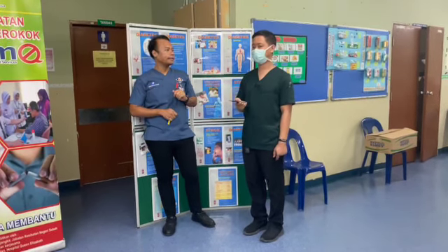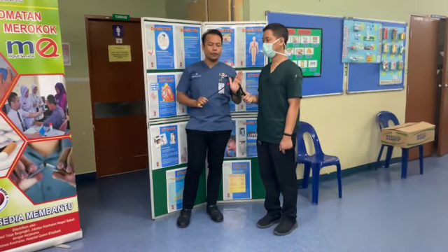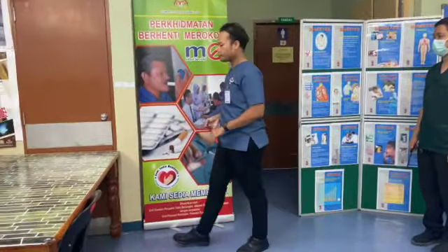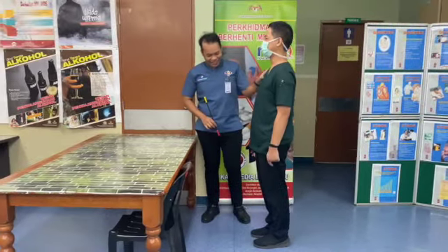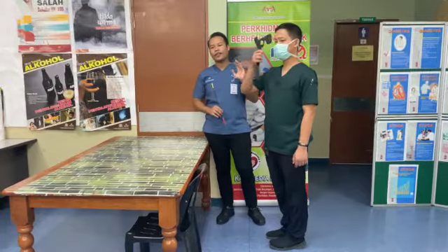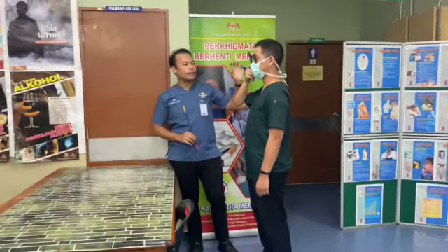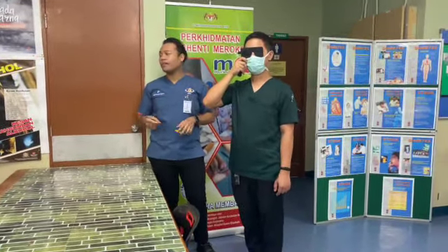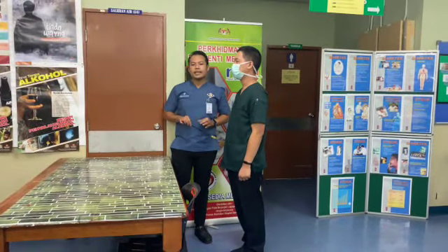But if the patient is unable to read with the pinhole, we need to adjust the distance from 6 to 3 meters. Come here please. The 3 meters should also be tested from the left or right eye and with the pinhole. If the patient is able to read from the top to the bottom, it's okay. The next is 3 meters.